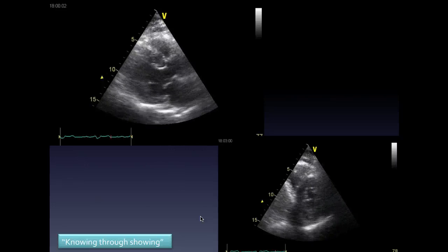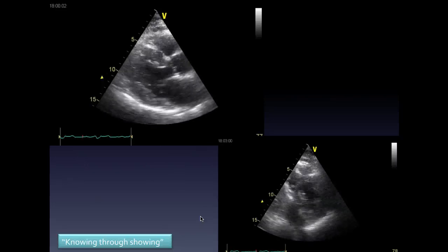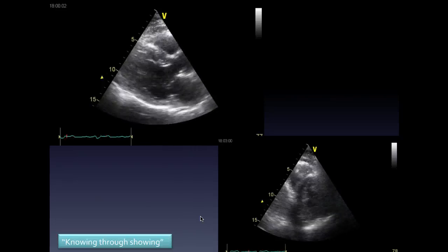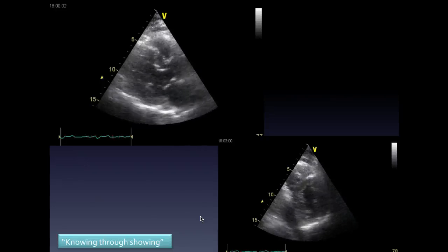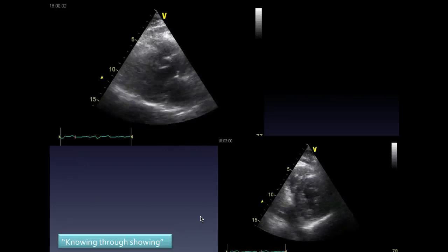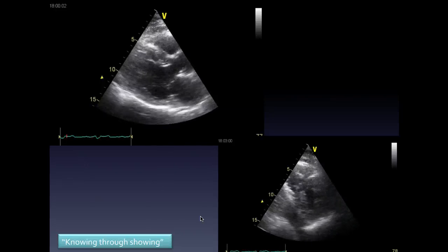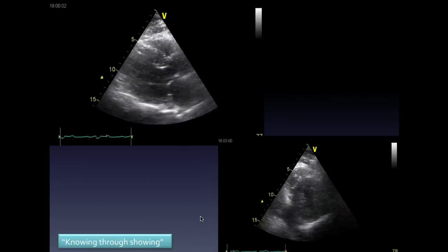What's your tissue? Yeah, nice job. But at 78, you can have a tissue prosthetic valve, better profile, lower gradients, avoid the anticoagulants and so on. And in fact, that's the critical piece of information. The radiologists are very good and robust at not reporting the study without being given clinical information. Sometimes the sonographers and the cardiologists and the intensivists may be a little bit soft and give an opinion without knowing all the facts, so we should be more careful.